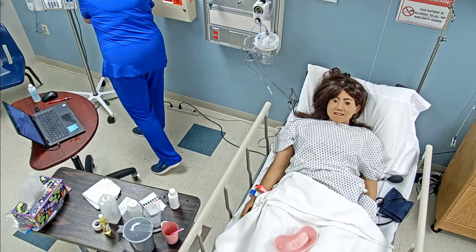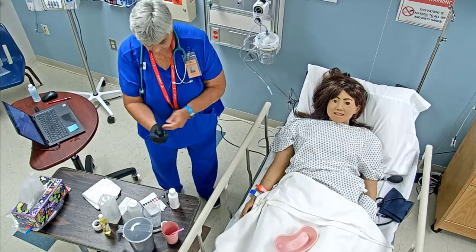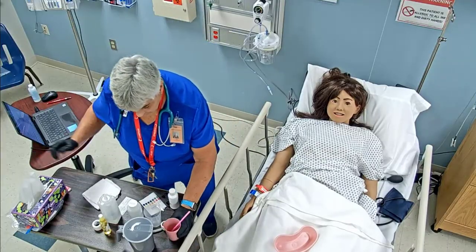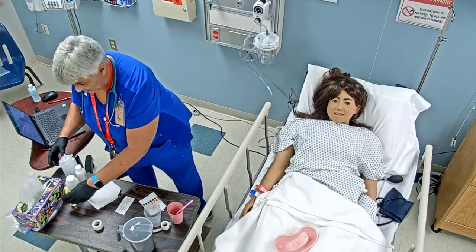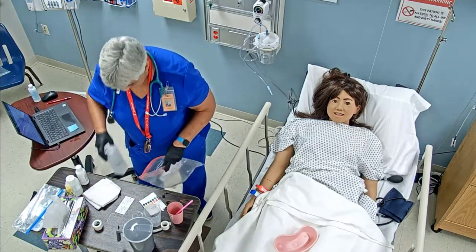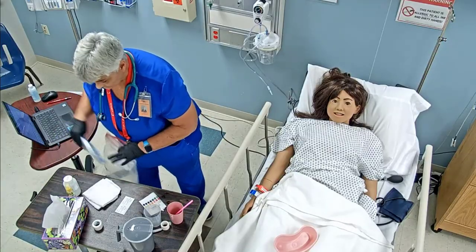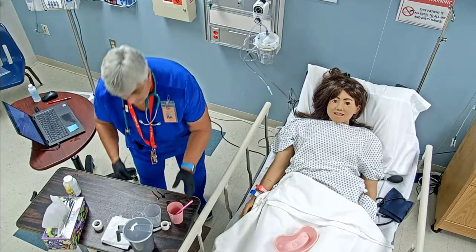We've made sure that the bed was in a low position. The side rails were up x2. The wheels are locked. Your call light was in position. Okay, and I'm going to leave, and remember, you're just going to be sipping on that. And so we would get all of our supplies and dispose of those. Now, this would stay with the patient. This would be gone because we've already put it in our bag. I'm going to leave a washcloth here for you, and then we would dispose of all of these.